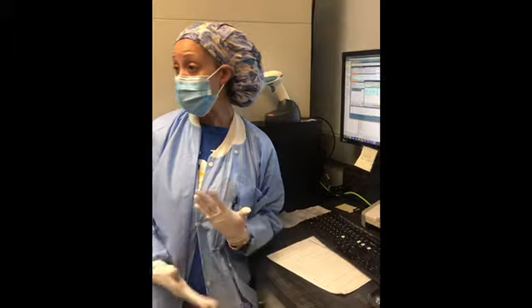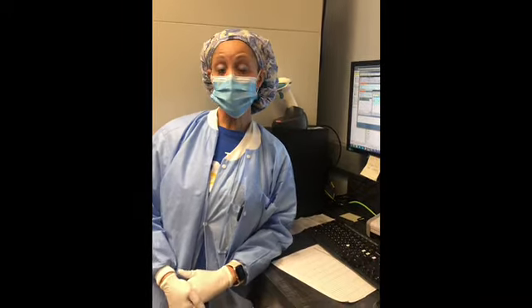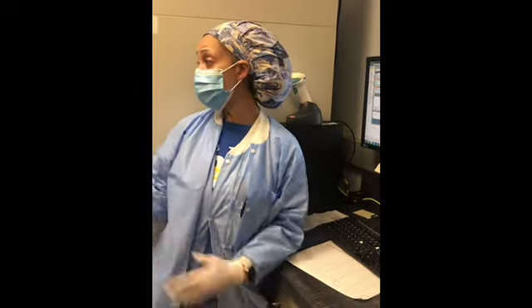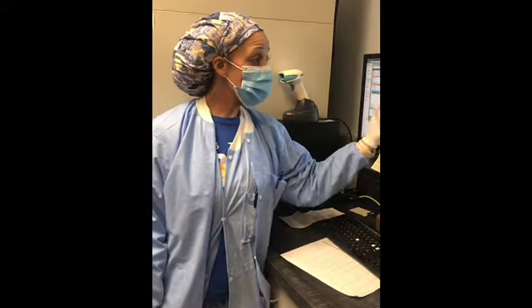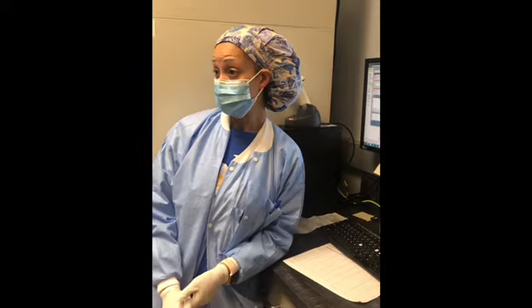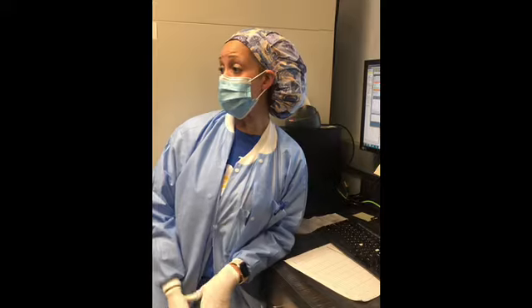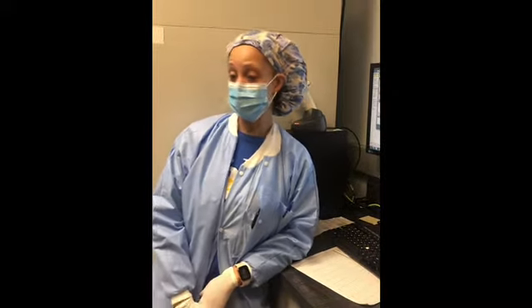If the patient is a bone marrow patient, call the floor, see if the patient was recently transfused somewhere else, check the Rulo, incubate 15 minutes at 37 degrees, all of those things to try to correct it. Now, I wouldn't accept it and result it until you have solved the ABO discrepancy. And then once you're able to justify it and resolve it, you go in here and you can correct it and resolve it, yes.